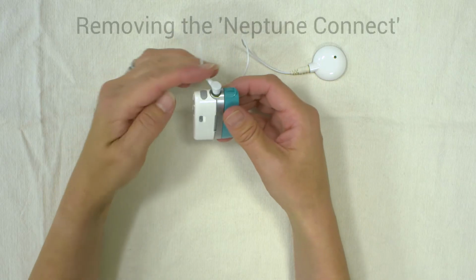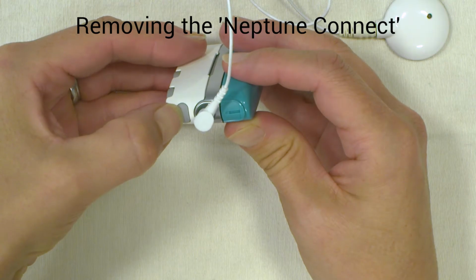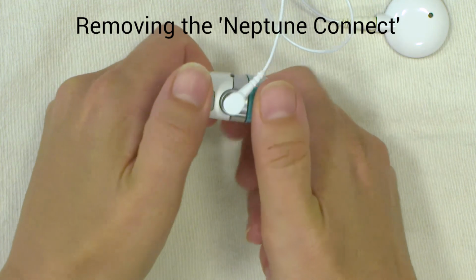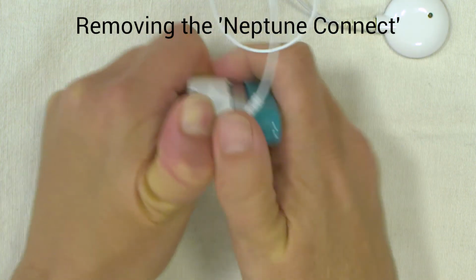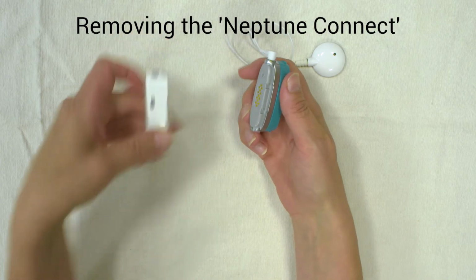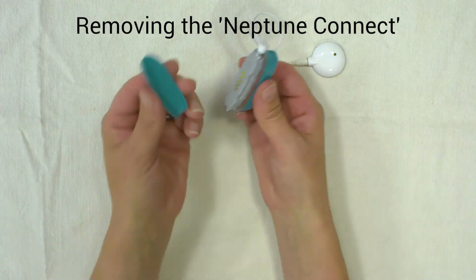In order to then take the connect off, there's a little button here at one end. Again, holding it, pressing the button down with your thumb. There we go. Didn't have the strength in my thumb. And then you can put the cover back on.